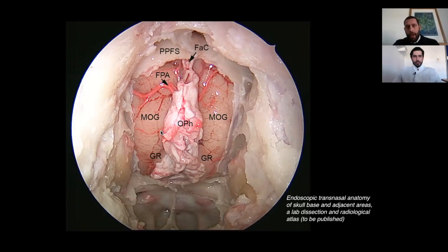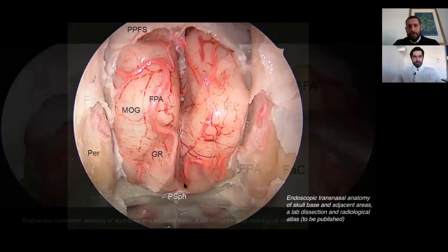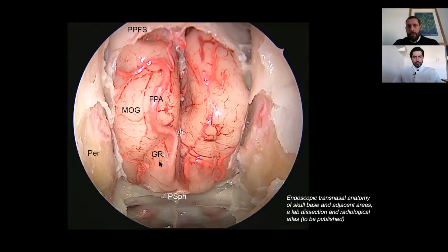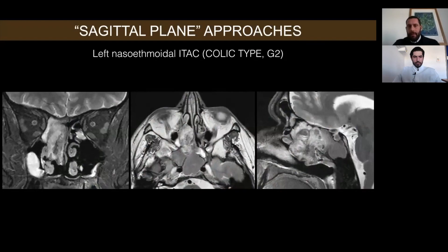We opened the dura bilaterally, exposing the frontal lobes and the branches of the medial orbital frontal arteries. We are now cutting the falx. This is the final view of our transcribriform approach with both frontal lobes well exposed.